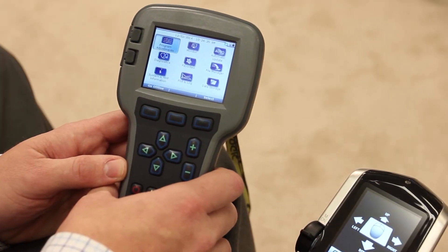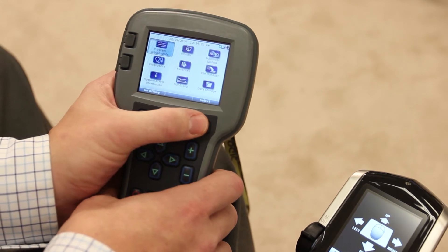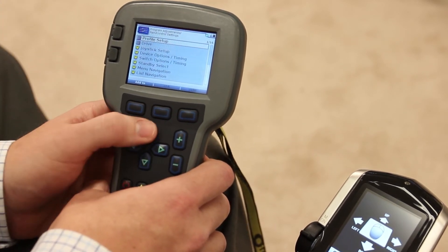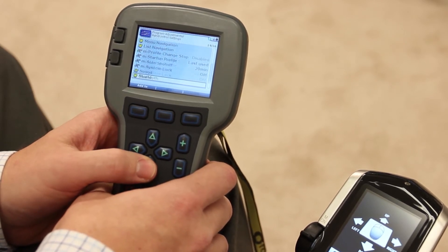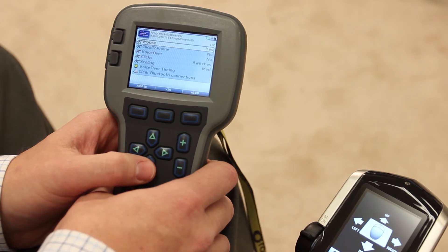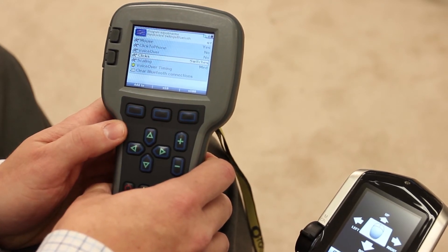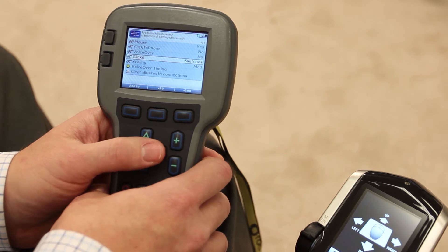We need to plug in our handheld programmer, which I've done so already. We need to go to program adjustments and hit select. Give a right command on hand control settings because we're dealing with a hand control. This time we want to give a down command on the touch pad until we see Bluetooth. Once Bluetooth is highlighted, give a right directional command with the handheld programmer and go down to clicks. This allows us to decide how the person is going to do the mouse clicks on the device that they're using.